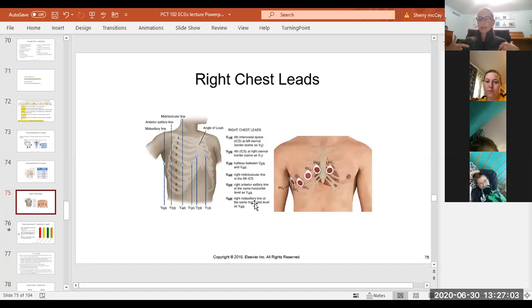So that means you would only have 1 lead on the left side and all of the other ones on the right side in the same pattern. And that's what this is showing you. So in this person, there's only 1 lead on the left side and all of the other ones are on the right. It's just like looking in the mirror and you just flip the person. You would only do that if that person has the heart on the wrong side. Does that make sense? Okay. So this is what that picture is.